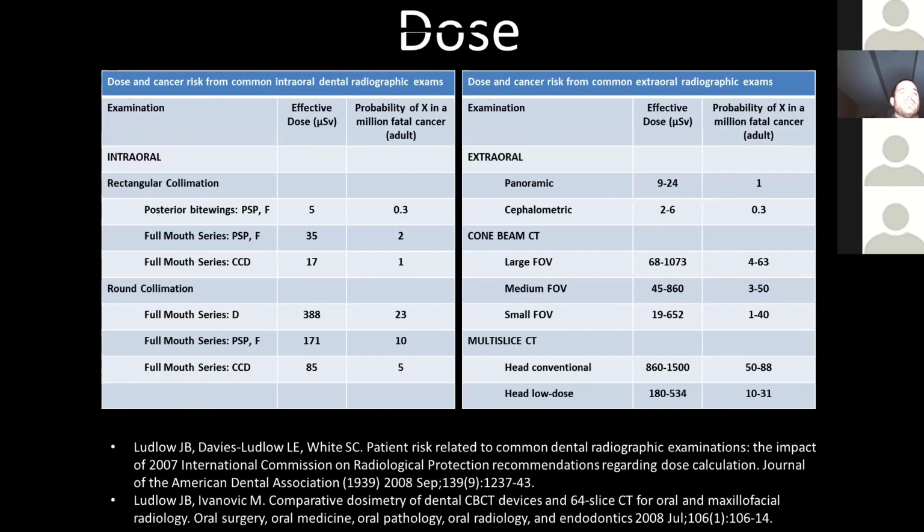If the patient brings in a CT scan from another office and everything's on that disk, for the most part, there's a couple exceptions, but for the most part, you can copy all of those files into a separate folder and be able to open it up later. There's some nuance around that. So again, if you're going to try and do that, experiment. Don't be afraid to copy and see if you can move things. As always, it's patient information, so it has to be handled securely.